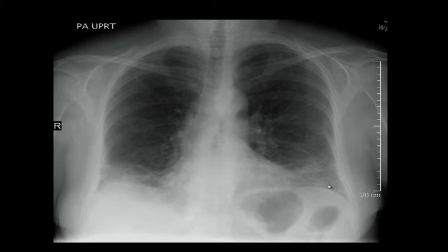Even the lung behind it is white or gray, light gray, correct? Yes. So this cannot be exclusively interstitial, because then you would see black with white lines, just like a ruled paper. But that's not the case. So there definitely is an element of pulmonary or alveolar change. Loss of volume, atelectasis, linear opacities, and some change in density.